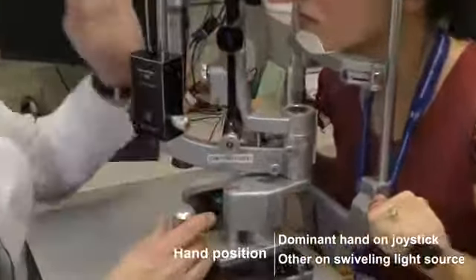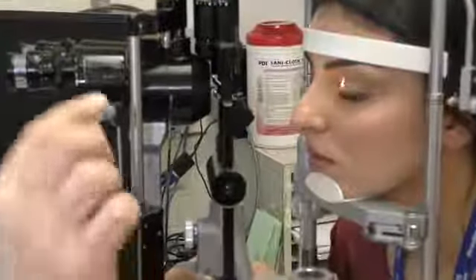Okay, so as you can focus here, you can see that when I turn the knob clockwise, it makes the beam wider, and you can see as we look at our eye here, the beam is getting wider as I move this clockwise. As I rotate the opposite direction, counterclockwise, the beam gets more narrow.